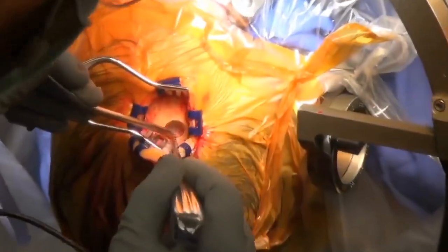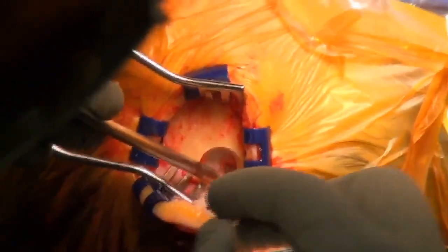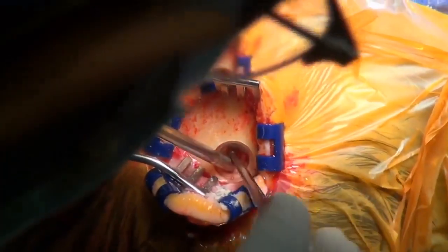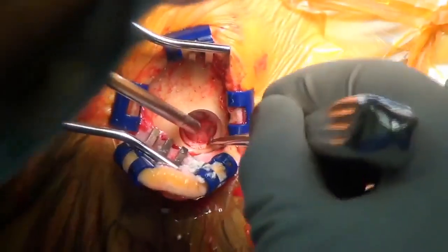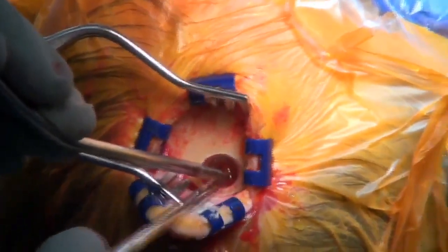Let's see a curette. So what's left behind after that drilling is a really thin sheet of bone.